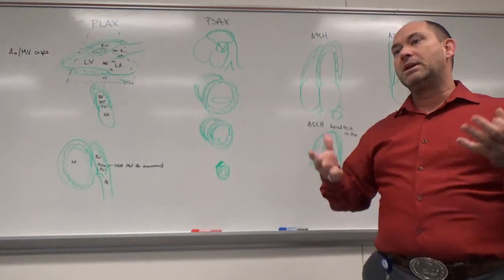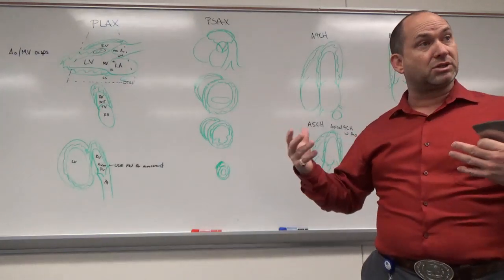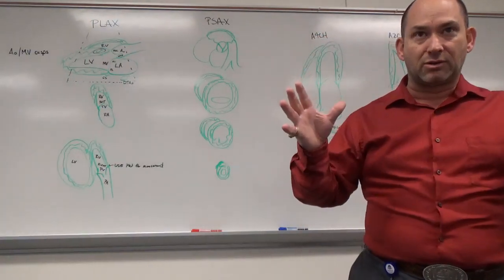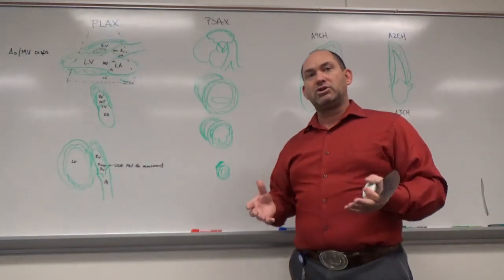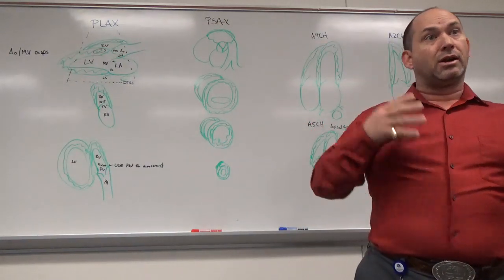Why is that? Because we're refreshing the oxygen in the body first, so the patient psychologically and physiologically doesn't have to hold their breath. It's not as hard to hold your breath, because before you didn't have any warning. It's like throwing you into the water all of a sudden and you start freaking out. Whereas if you have a chance to breathe it in and hold it, now I can go down longer and I'm prepared for it.